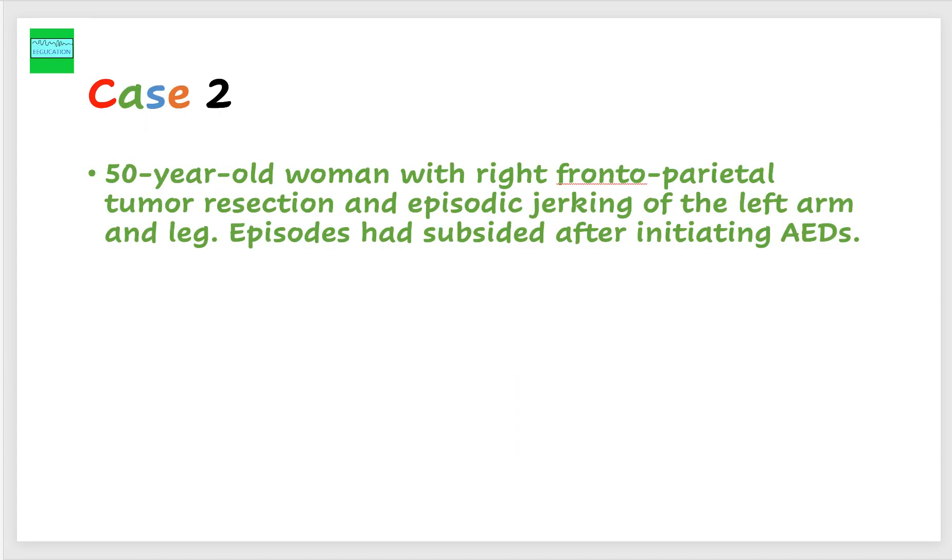Let's look at case number two. This is a 50-year-old woman with the right frontal parietal tumor resection and episodic jerking of the left arm and the left leg. Episodes had subsided at the time of the EEG, so the patient was not actively demonstrating any of the clinical changes.